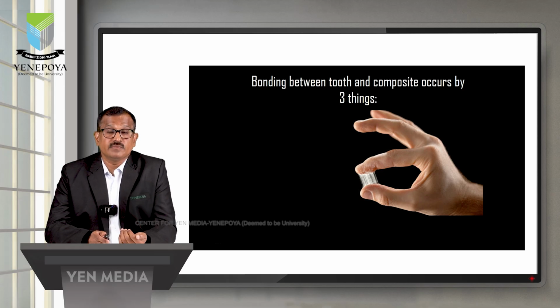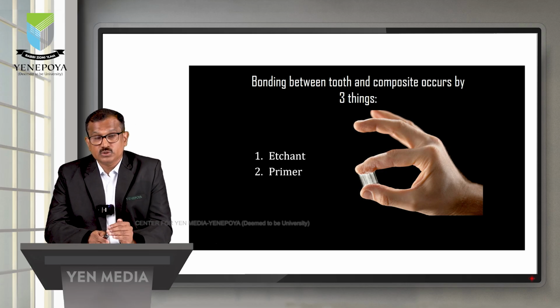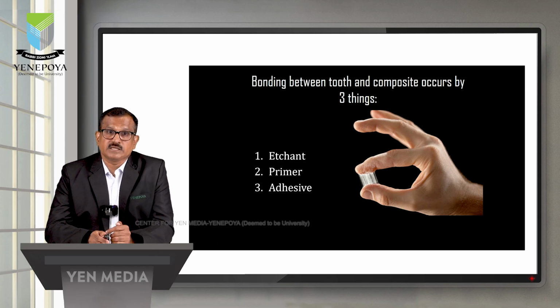So that takes us to bonding next, because bonding between tooth and composite is based on this. What we should understand is that it is based on different substrates. We have 2-3 substrates here: cementum, though not common, and enamel and dentine, which are the most common. We have to understand how these materials act differently on each substrate. That's how we should understand bonding. So let's first see what the first step in bonding is. As you all know, it is the etching procedure.